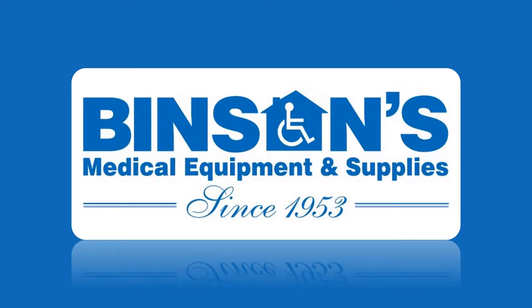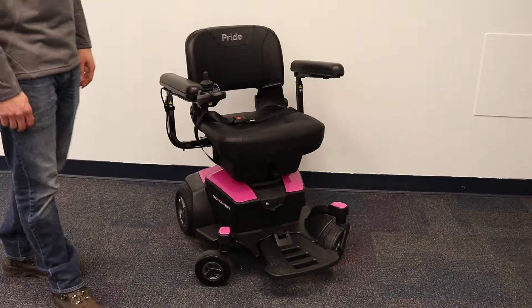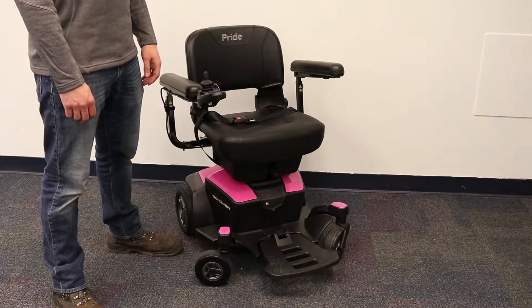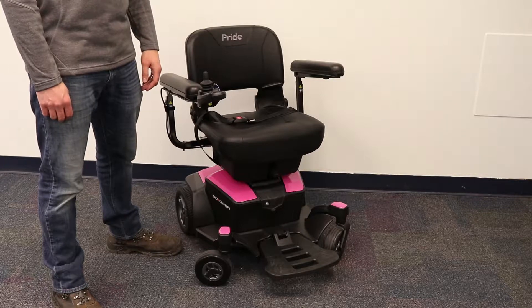This video is brought to you by Binson's Medical Equipment and Supplies, your one-stop solution for all your home medical needs. Today, we will be going over how to use and break down a portable power chair. Please note that each power chair will differ, but many of them will function just like this one.